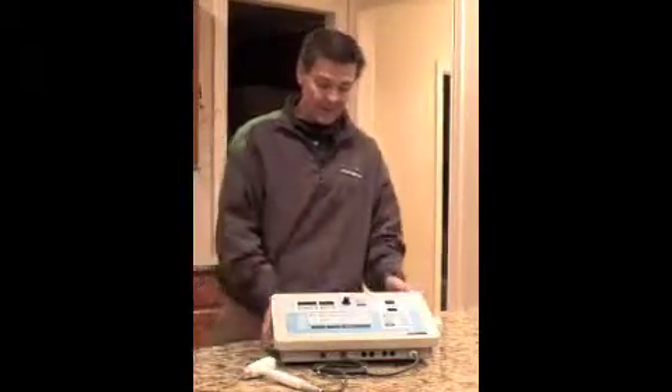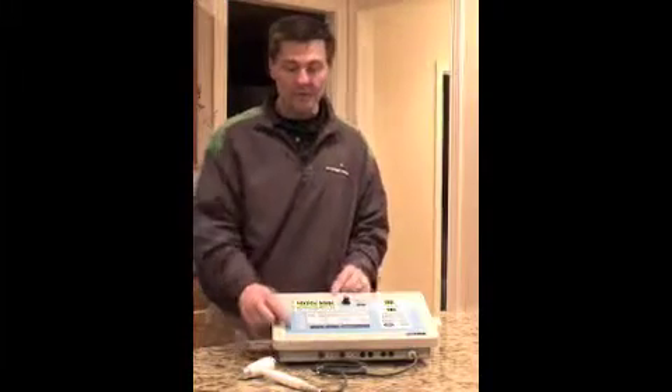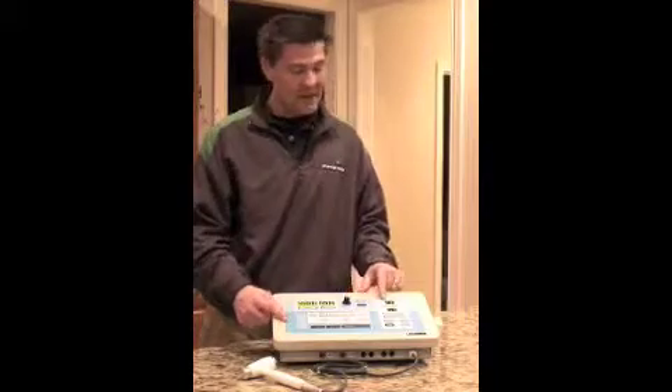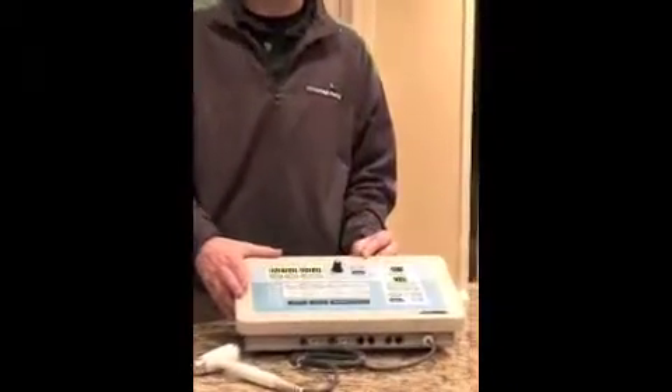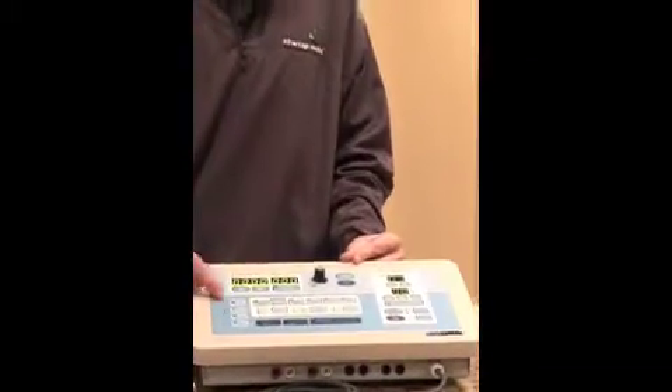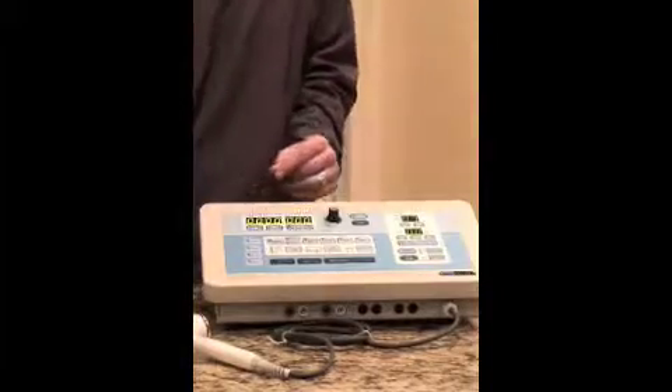The power button is on the back of the machine. When you first turn on the machine, you'll notice that you get some beeps. It's going to run through a verification to make sure that everything is operating correctly, and all of the buttons along the outside edge and the top row will be blinking.